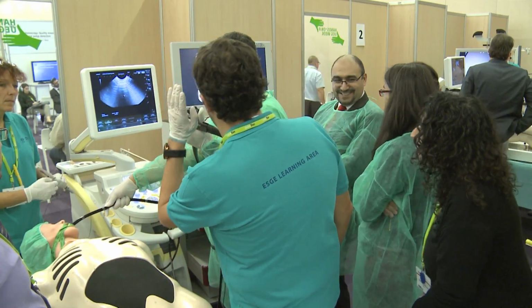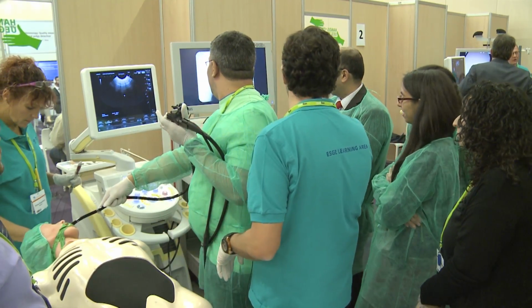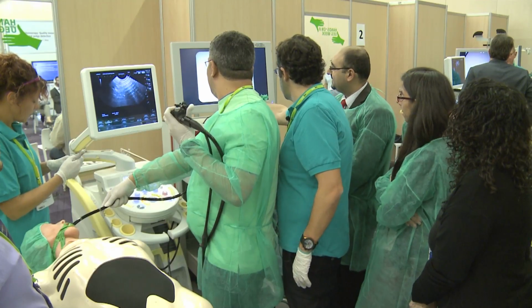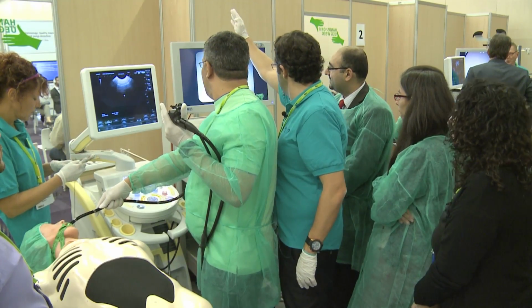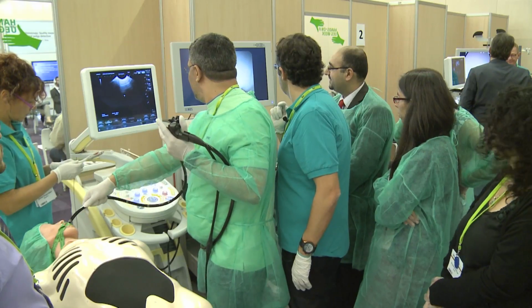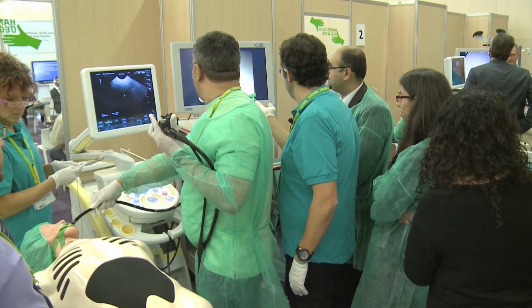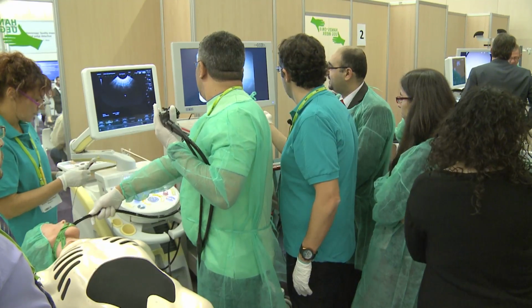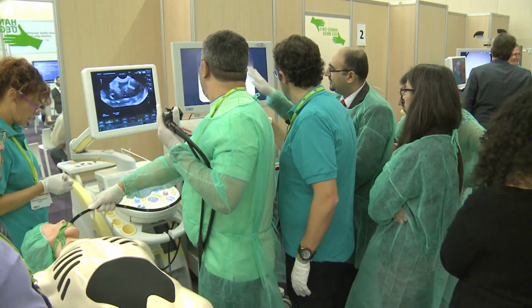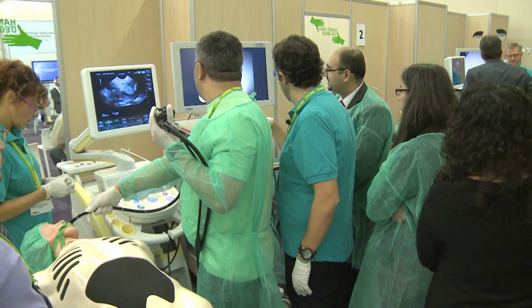Remember that you see not in the front, but it's an oblique view. So you are not going where you see. For instance, if you want to go inside, exactly, you need to go in that direction. Slide. Exactly, go ahead. There is resistance, so just lift the tip a little bit. Okay, that's it. Go on. Perfect. Go on, try to place it. Okay, go ahead. So now, okay.